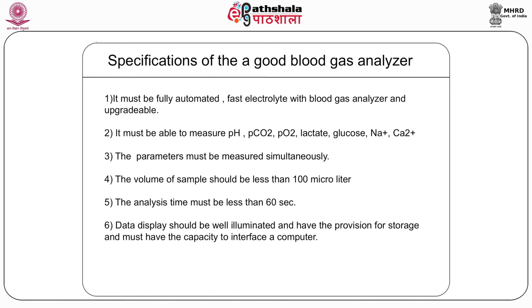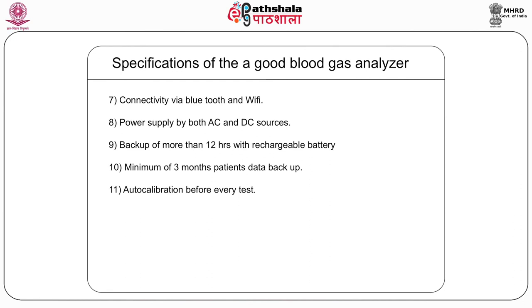The data display should be well illuminated and have the provision for storage and must have the capacity to interface with a computer. It should also have connectivity via Bluetooth and Wi-Fi. The power supply should be by both AC and DC sources. Backup of more than 12 hours with a rechargeable battery and a minimum of 3 months of patient data backup. It must also do the auto calibration before every test.